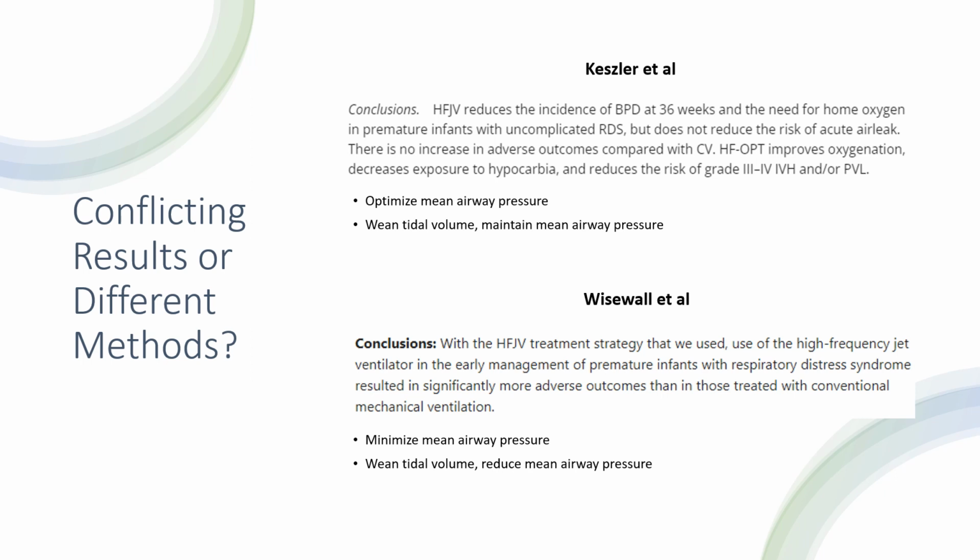When the patient's carbon dioxide levels decreased, the tidal volume would need to be weaned. The Weiswall group would lower the peak inspiratory pressure without changing the PEEP, resulting in a lower pressure change, thus a lower tidal volume and a reduction in mean airway pressure. The Kessler group would lower the peak inspiratory pressure while increasing the level of PEEP to reduce the pressure change while maintaining the same mean airway pressure. While neither group was wrong, this does highlight the importance of management strategies and the value of experience with mechanical ventilation.